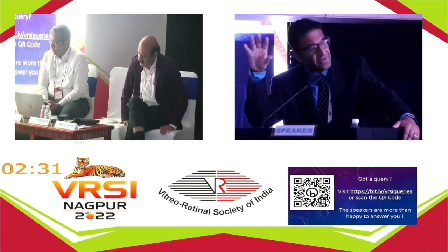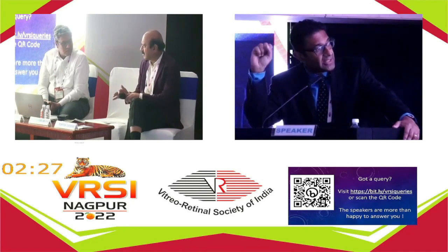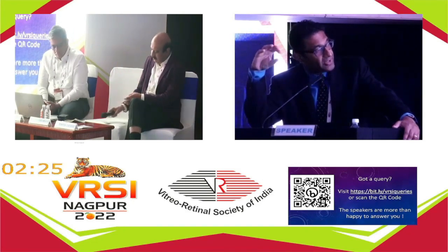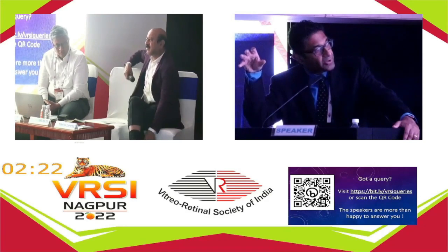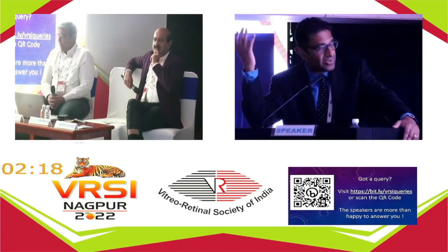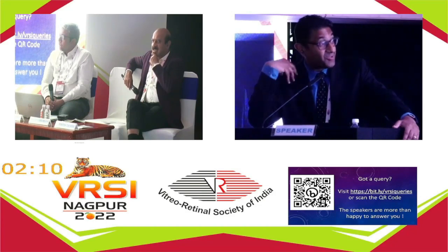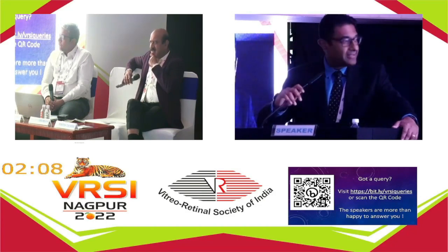The previous data, when we were asking how often we find lesions that would change our judgment, was based on old clinical trial data. The latest data with Protocol AA really highlights that. The consideration in the discussions we're having in the States is mainly about whether every patient who comes in at baseline with diabetic retinopathy now needs an ultra-wide field fluorescein angiogram. That's what we're trying to avoid doing. 10%, according to you? What's that?